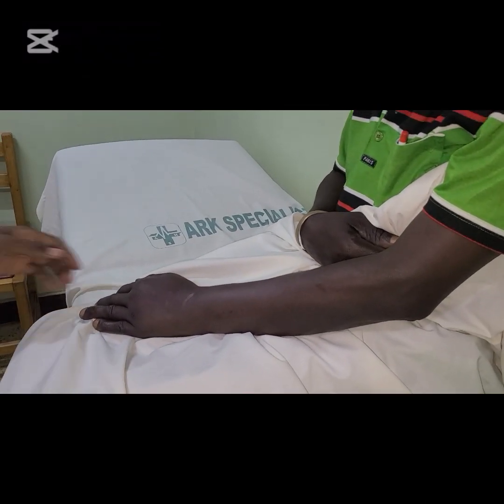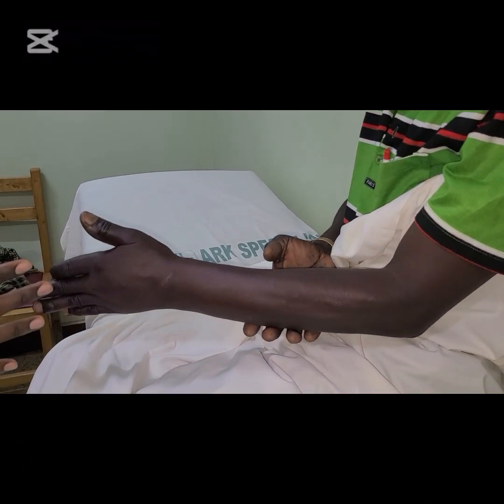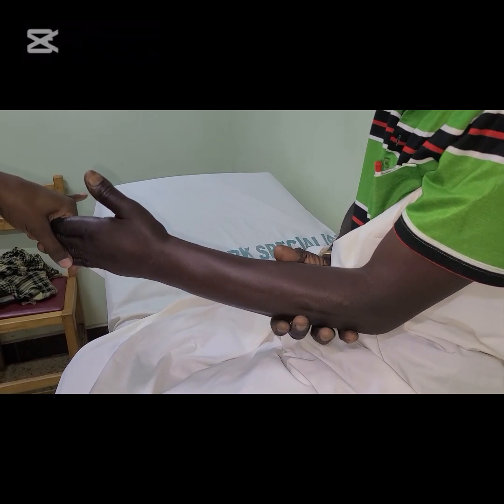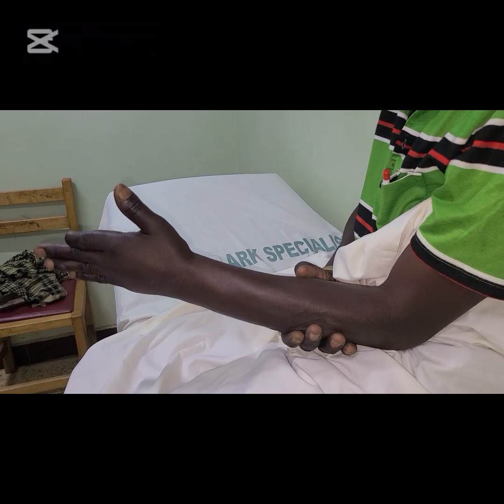So he came with pain in the distal forearm with inability to pronate and supinate. Don't mind about the stamp on the index finger. That is an injury he sustained some time back.